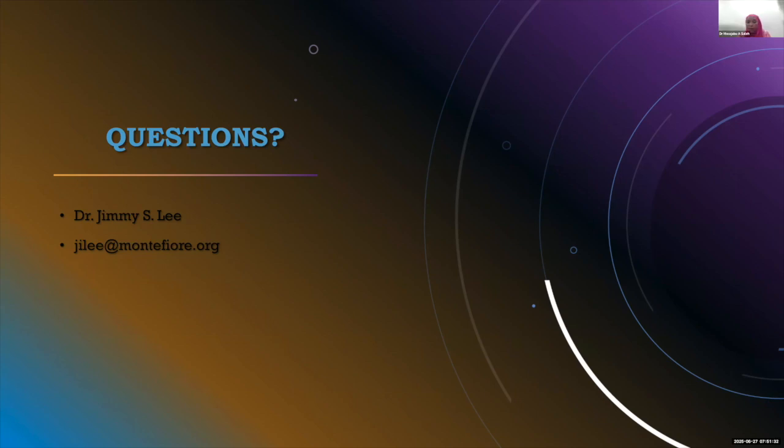All right. Thank you. Another question: are there any particular sequences in addition to the standard T1, T2 sequences for diagnosing SIH? So for SIH, we're looking for all the what we call signs of sagging in the brain. A regular MR brain usually has all you need. Particularly, you want to get a good quality sagittal image. So sagittal T1, then you can look at brain stem sagging, cerebellar tonsils, suprasellar cisterns, that kind of thing.